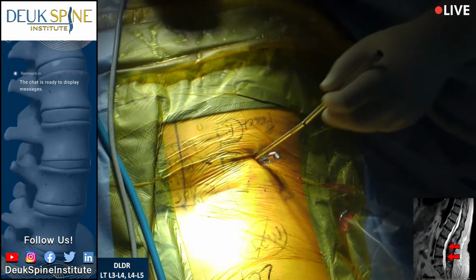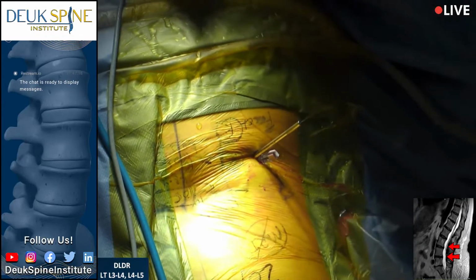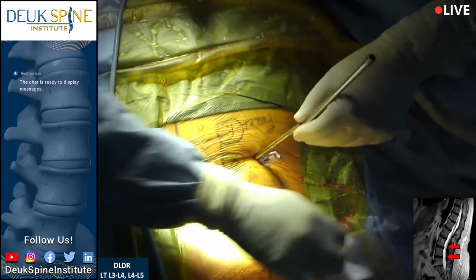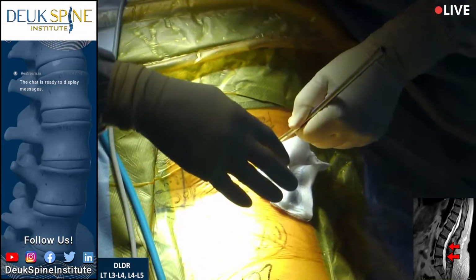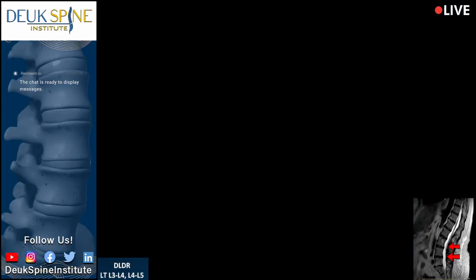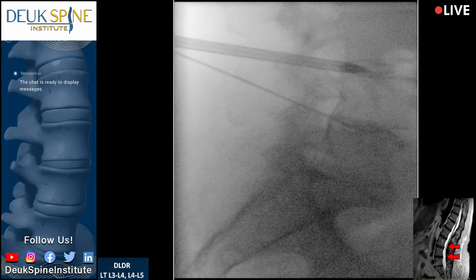She okay? She's perfect for me. You can make her a little lighter if you want. Now we use a little Novocaine in the injection, the discogram, to numb up the disc so that I could do this part without causing her a lot of discomfort. And that's helping my anesthesiologist because he's not having to use as much anesthesia.